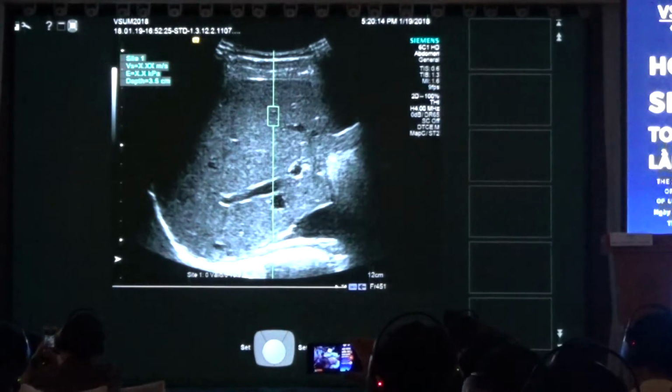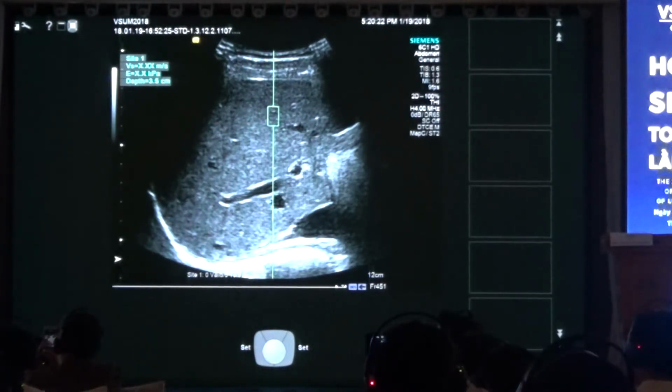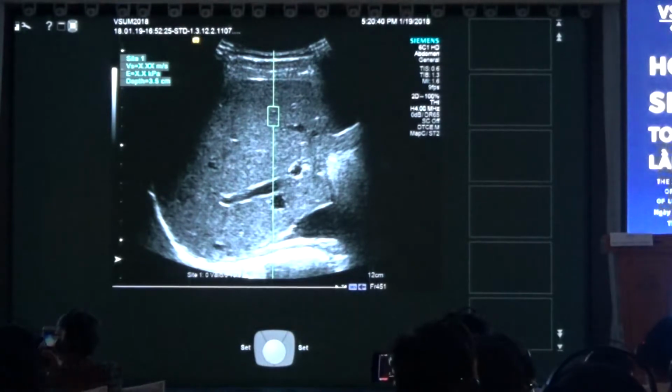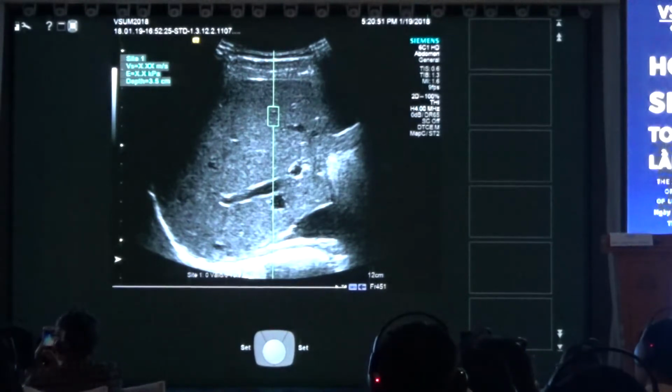It's a short period. And you might be thinking, why does this German not take a position here, a position there, and a position here in the liver to get more representative results? You might think about that. That's fine. But take 10 measurements in one point, 60 seconds or even less, and for the next 10 you go to a slightly different place and look over there with 10 measurements. So you might go for that.